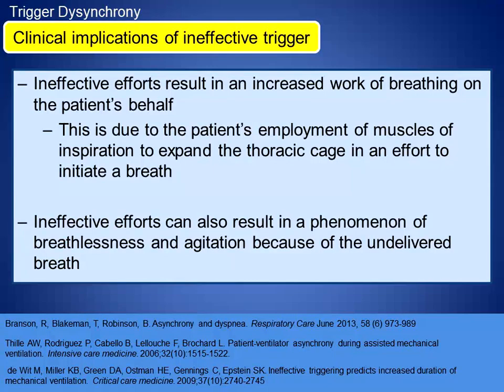The implications. So I would say this: if there are ineffective efforts, what you have here is, on the patient's behalf, an increased work of breathing, essentially. They're employing their inspiratory muscles to try to trigger a breath, and they are not being rewarded with said breath. So it's a wasted effort, and there's a significant increase in work of breathing on the patient's behalf.